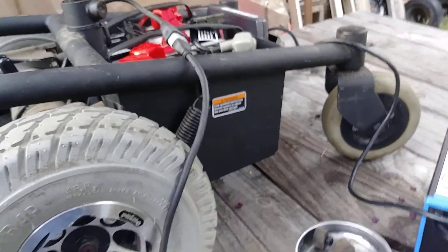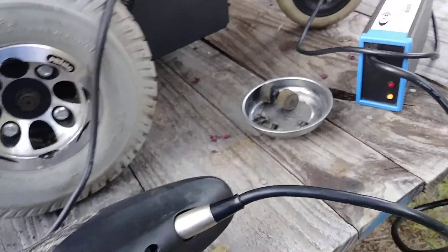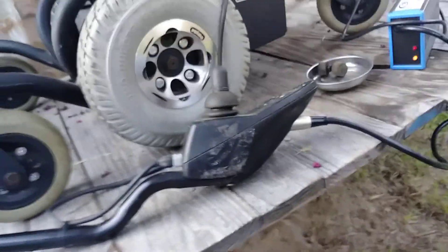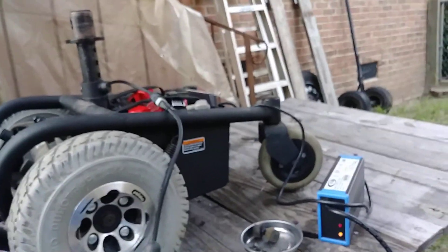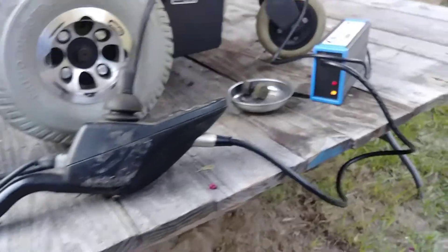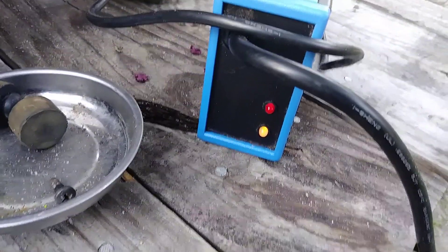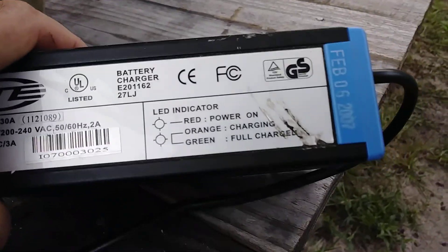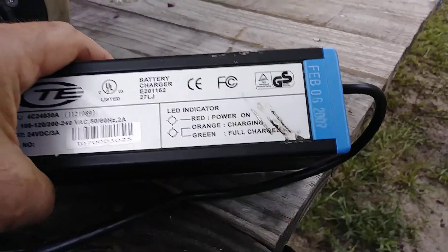For the life of me I could not figure out where you charge this thing. I looked all over it and said there's no charging port. I had to go look through the manual and finally found out — you charge it at the joystick, which only makes sense. Somebody handicapped isn't going to want to plug it in the bottom of the unit; plug it right there where it's easy to get to. It's throwing an orange light — looks more yellow on camera, but it means it's still charging. A green light means fully charged.